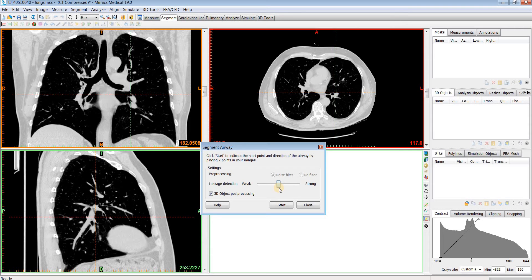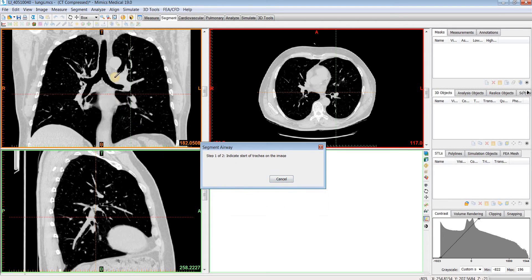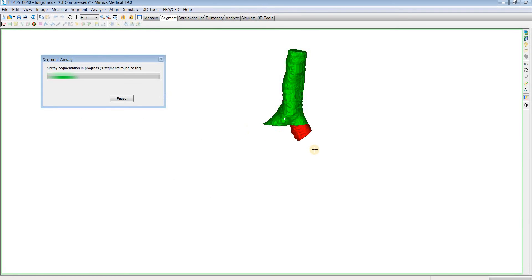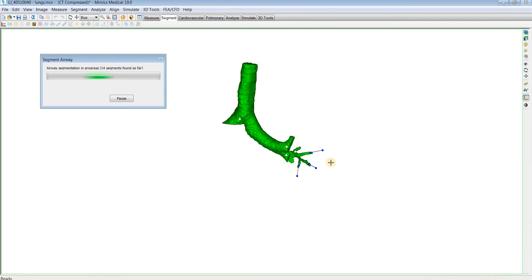If you get a lot of leakages, you could redo it and make the detection stronger. Or if the segmentation doesn't detect as many branches as you'd like, you could redo it with a weaker leakage detection. Once you have that set, just hit Start. Then you'll want to indicate the start of your trachea, and then indicate a second point below that first point to indicate the direction, which will automatically begin the segmentation process.